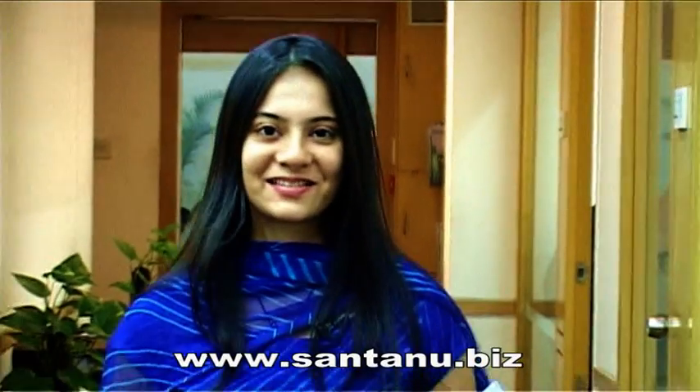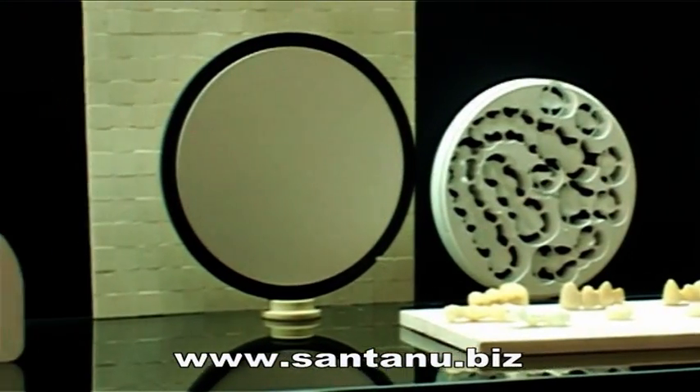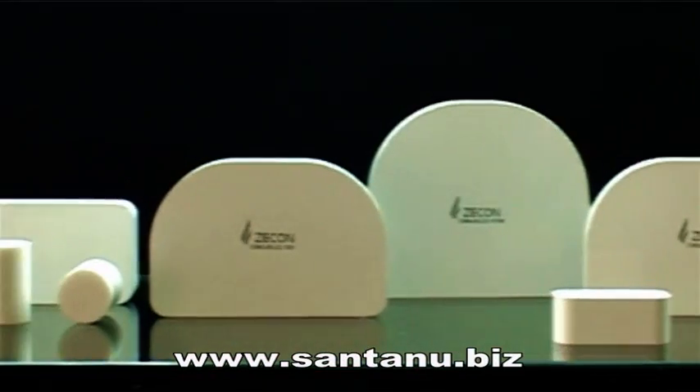Natural smile is now for all. Gone are the days when only an affluent few could afford that smile. International quality ceramic dental blanks and restoratives are now very much within your reach.